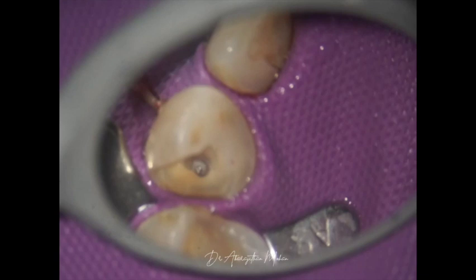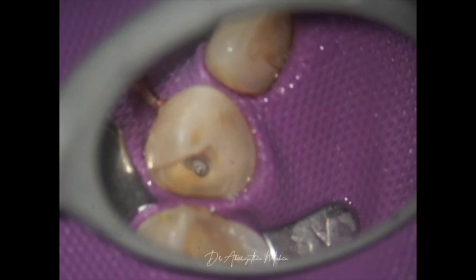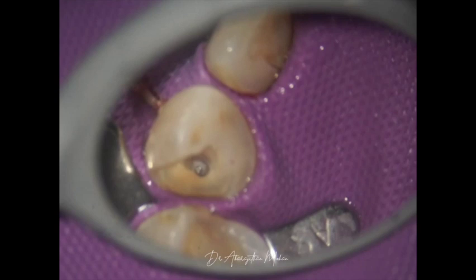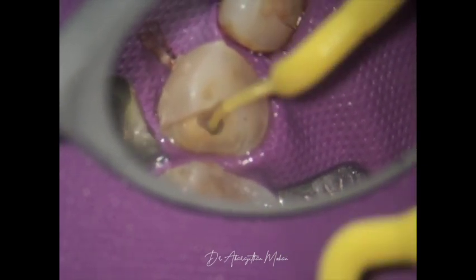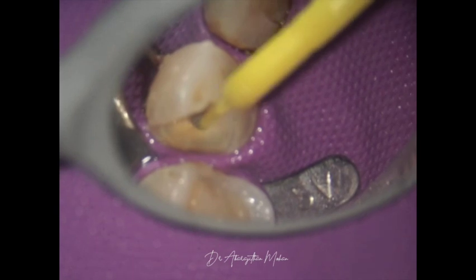You can see I'm using this in a passive mode for even middle and apical third activation because the polymer tip is able to go beyond the curve. We need more studies now, because all the previous studies indicate that metal tips may not be efficient beyond the curve — but will these plastic ultrasonic tips, which we know will have more energy, be more effective than sonics and ultrasonics? We need to wait and watch. This is just a comparison with the airsonic device which I'm currently using.